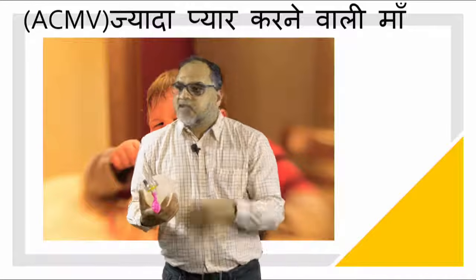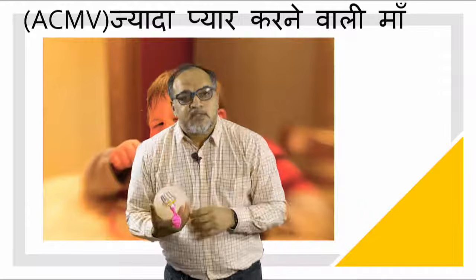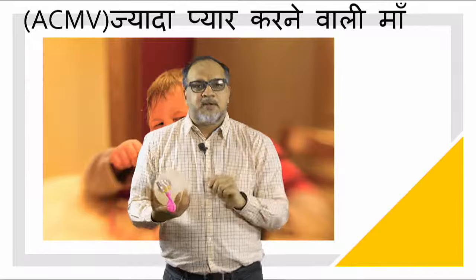What will happen? The patient will hyperventilate. The patient will wash off his CO2. The patient will go into respiratory alkalosis. So ACMV is good, but the problem is the patient hyperventilates with ACMV. Why? Because every patient triggered breath is supported with full tidal volume. In CMV, patient triggered breaths were completely disregarded.